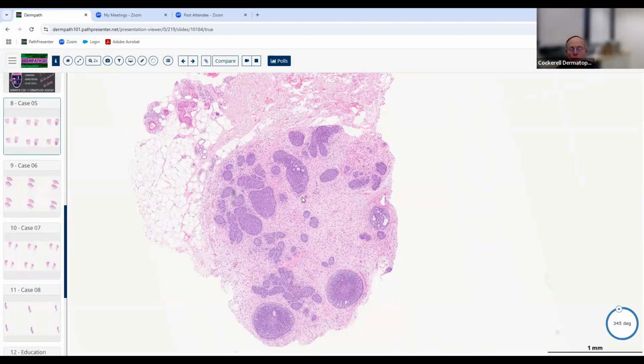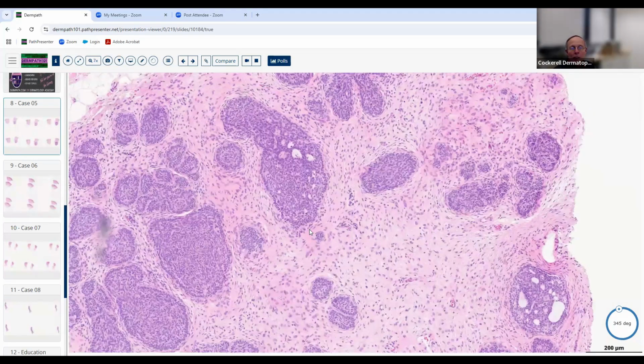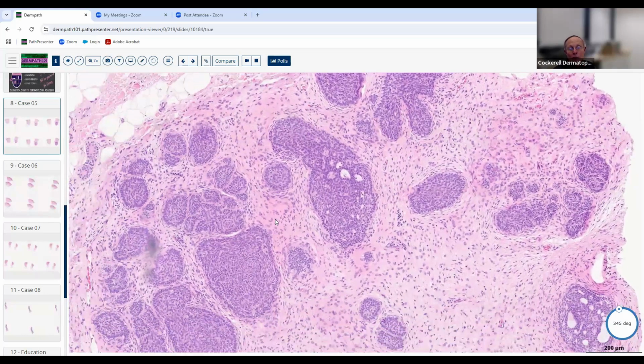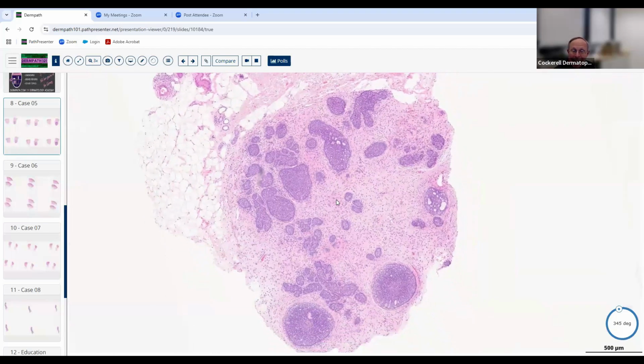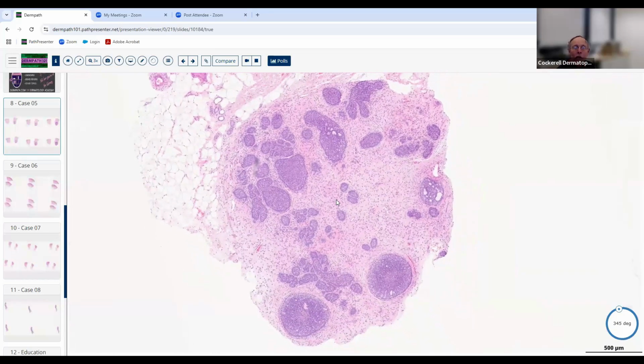There's just a little bit of the fibromucinous stroma most of the time in a basal cell. And if there's clefting, it often occurs in a basal cell between the epithelium and the stroma. In these type of lesions, if there's clefting, it occurs within the stroma itself. So that favors benign adnexal neoplasia.